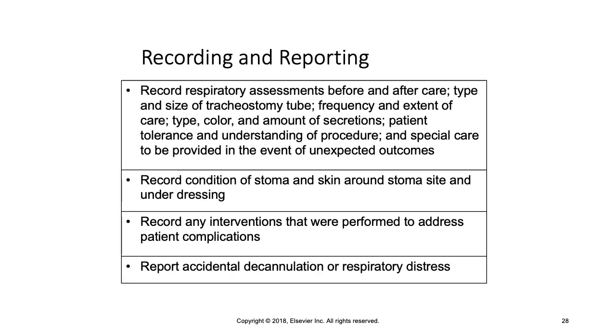Recording and reporting. You'll do a focused respiratory assessment prior to doing your tracheostomy care. So you want to document that before and after, the type and size of the tube that the patient has in place, the care that you provided, the type, color, amount, odor of secretions, how the patient tolerated it, any unexpected outcomes, and the interventions that you provided as a result, the condition of the stoma and the skin around the stoma, and, like I said, any unexpected outcomes and how you dealt with those.